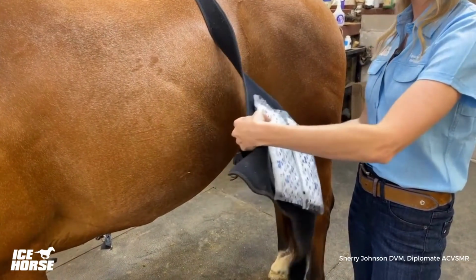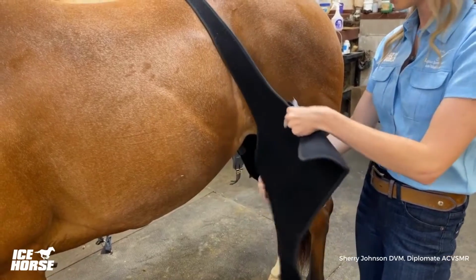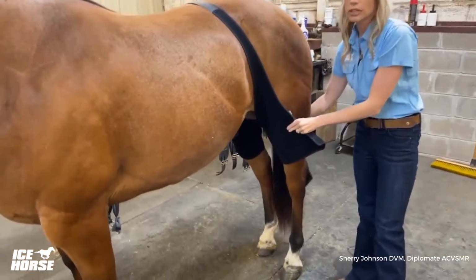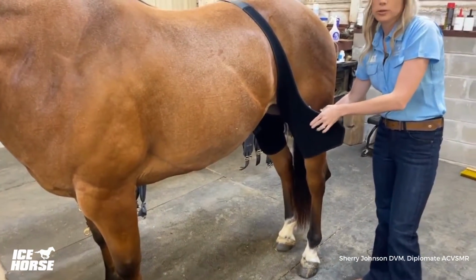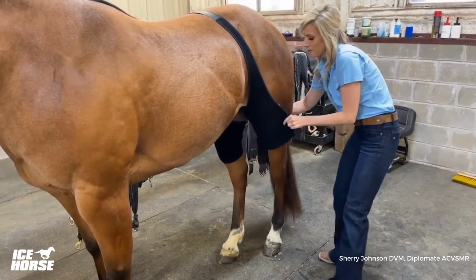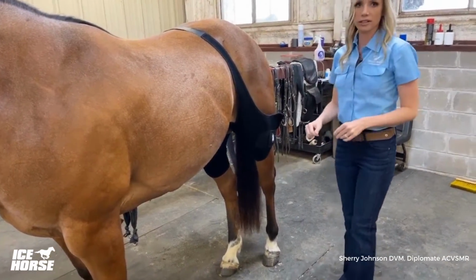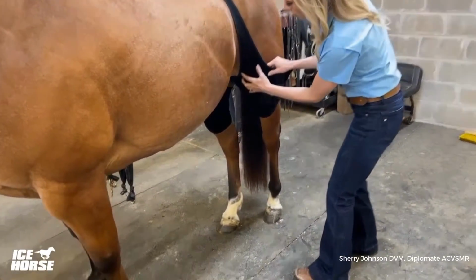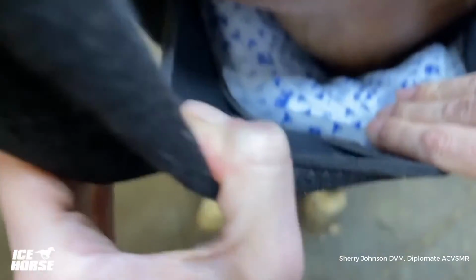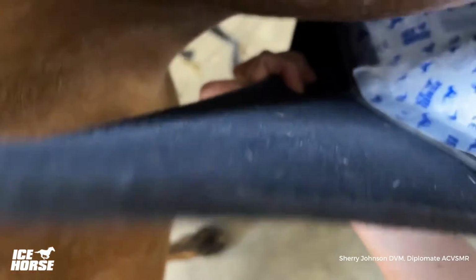So the other stifle is already in place, and once I get my ice in place, then I actually, again, this is a pretty nice horse. If you're doing this for the first time, you always want to have a handler and be safe and not do what I'm doing. But then I go ahead and get it strapped in, and it's one easy strap, and you're ready to go. And if Julie, if you want to come up and show the camera where these ice packs are located. So we've got nice femoropatellar joint coverage and on the inside as well.